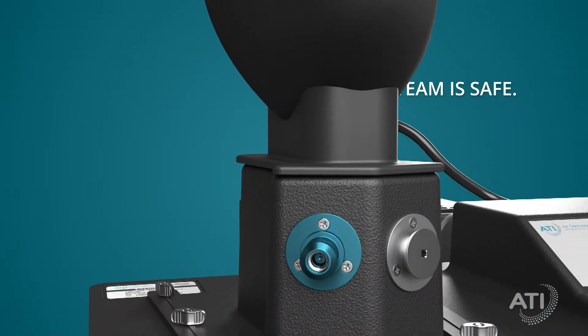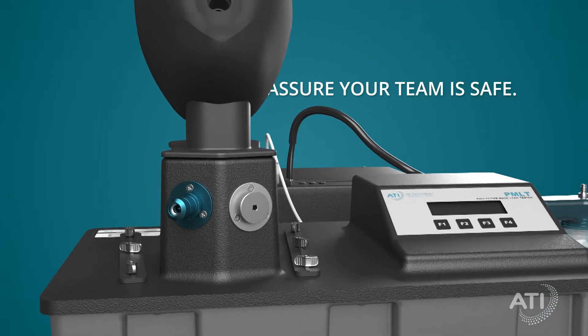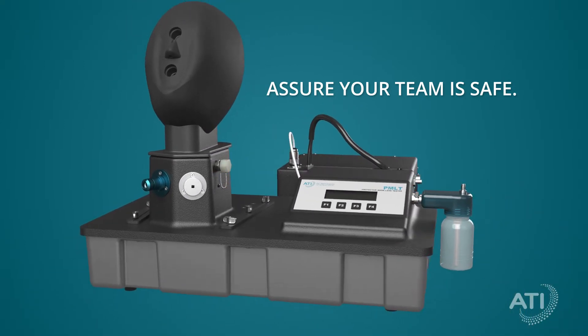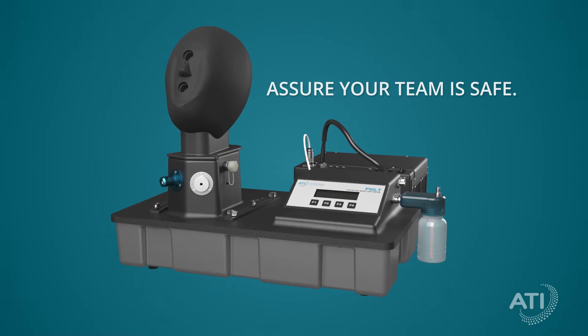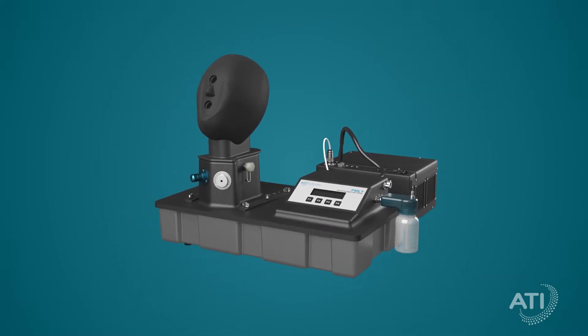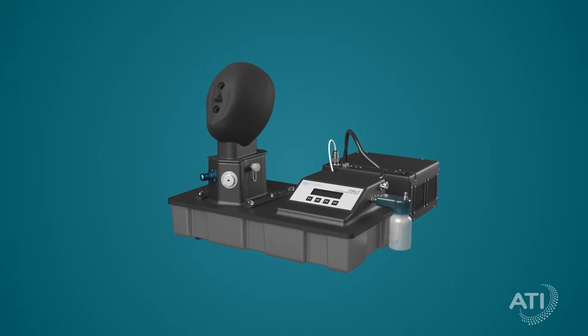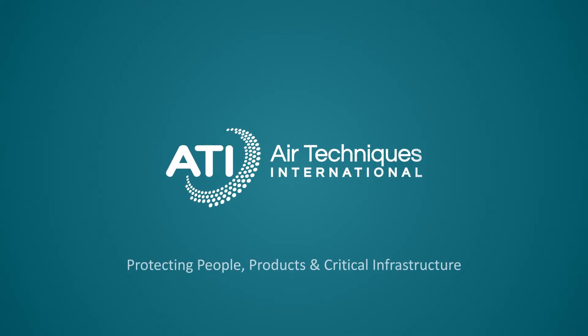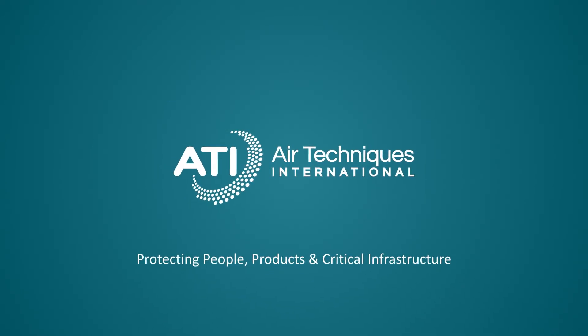In these times of increased sovereignty concern, the PMLT's system of mask integrity testing and user fit testing helps assure your team is safe. The PMLT has been designed and developed to meet the needs of those who protect others. ATI — protecting people, products, and critical infrastructure.